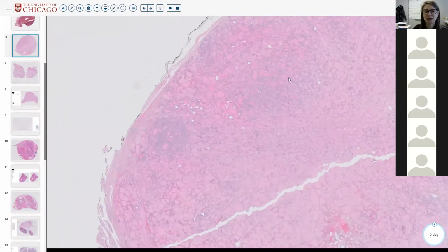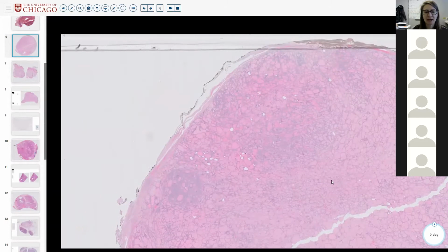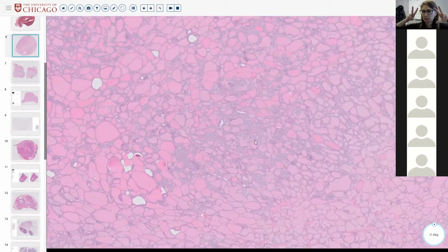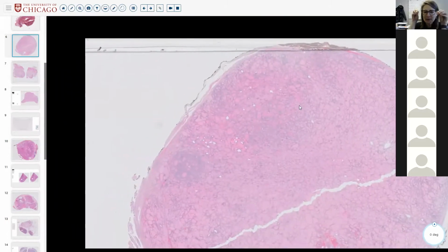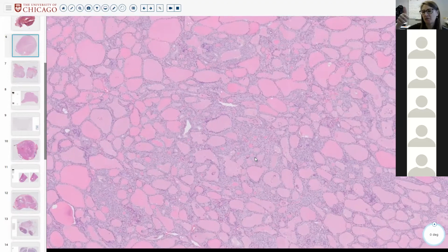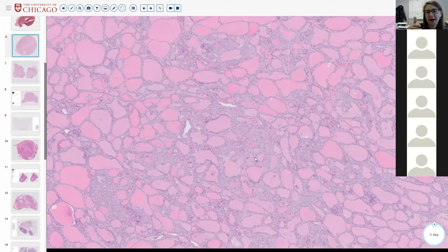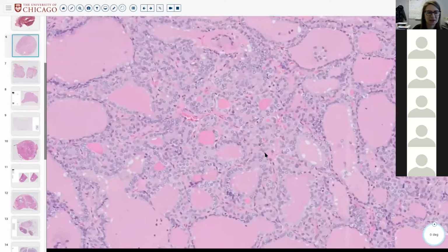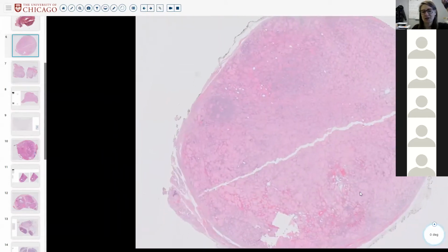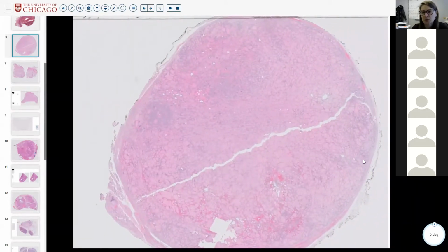I don't know how many of you follow the old literature, but Rosai wrote a paper many years ago about the so-called sprinkling sign. If you look at low power, you can see hypercellular areas sprinkled within. This sprinkling sign was thought to signal the follicular variant of papillary carcinoma, which in this case would now be a NIFTP. I think that's interesting. He was right, there is this weird sprinkling, but it's no longer a sign of carcinoma. It's just a sign of, hey, go look at those nuclei. Maybe you want to call it a NIFTP. Okay.